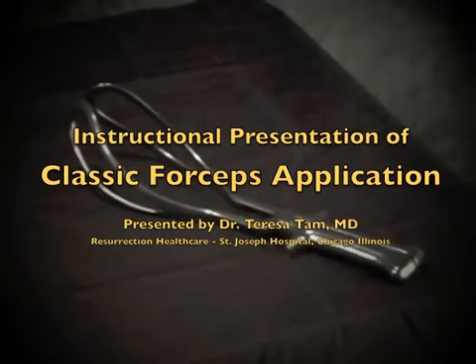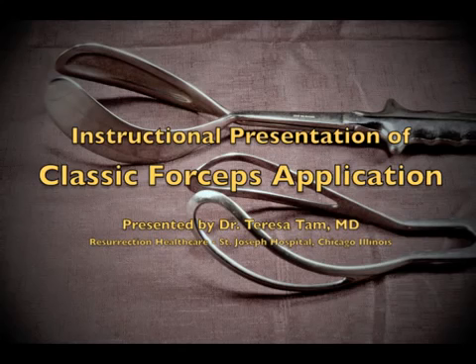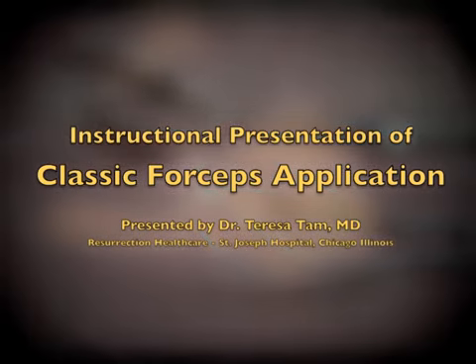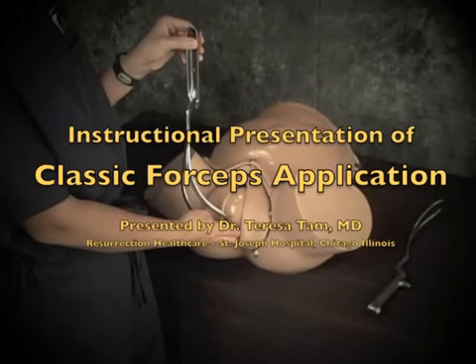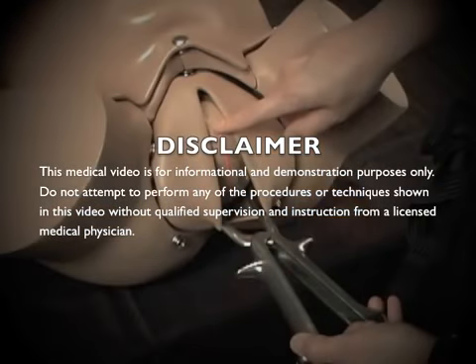Forceps use in obstetrics has become a dying art, with most obstetrics and gynecology residency programs struggling to teach proper forceps application. Most graduates are uncomfortable with forceps use in clinical practice. This educational video teaches the use of classic obstetric forceps. Learning proper forceps application through a procedural video in conjunction with hands-on training will promote patient safety and provide self-paced instruction.